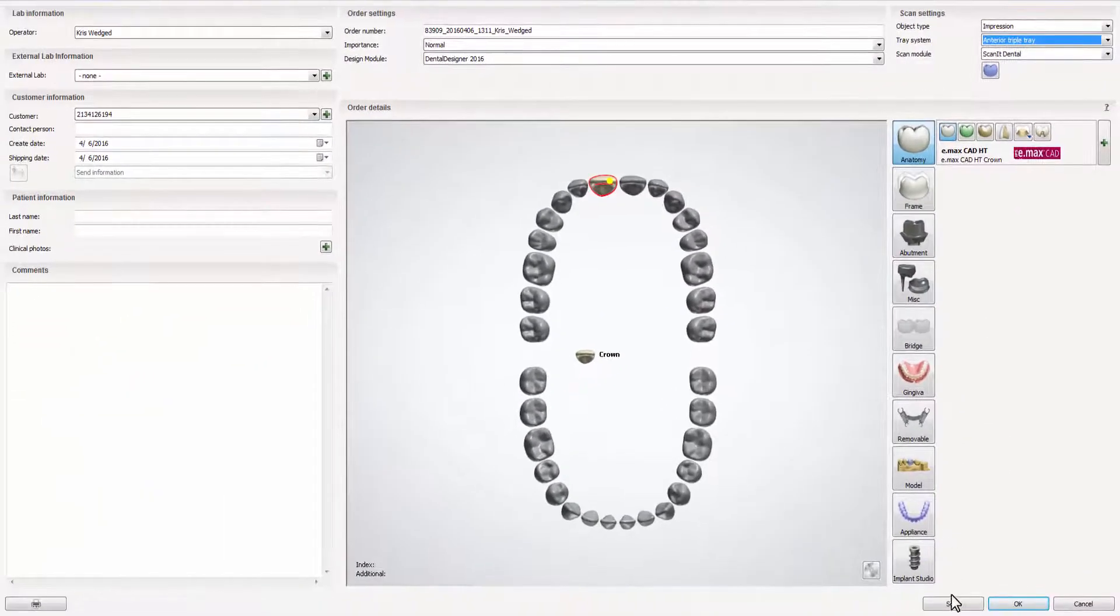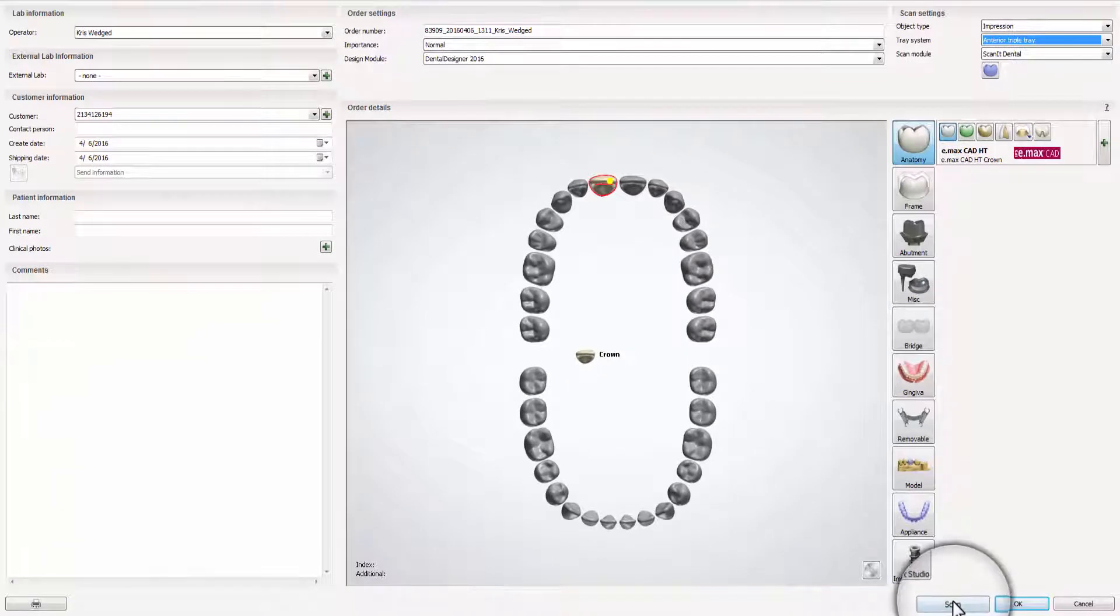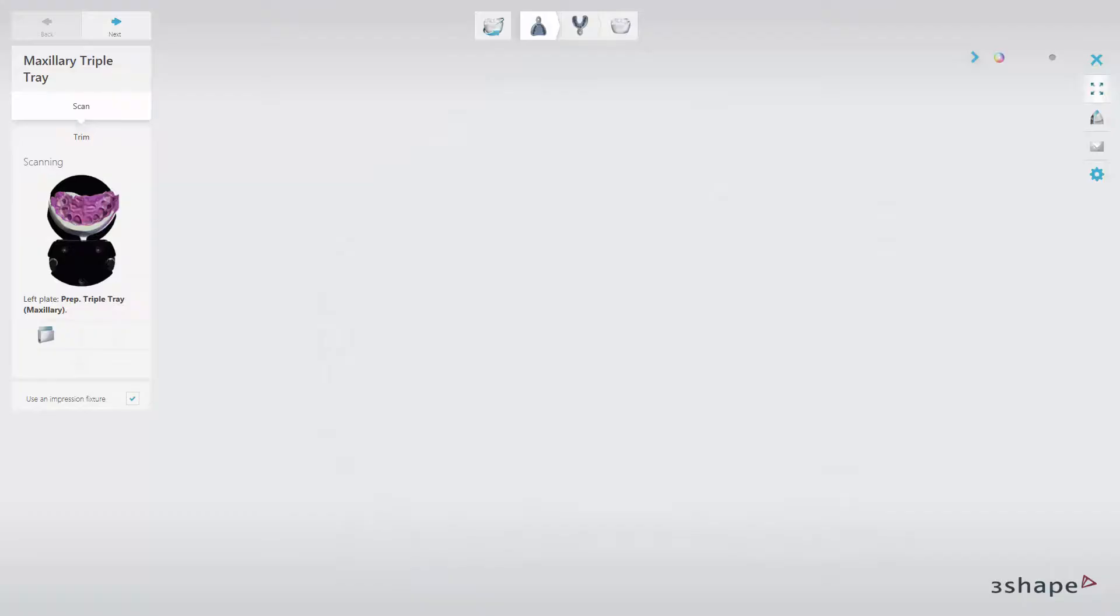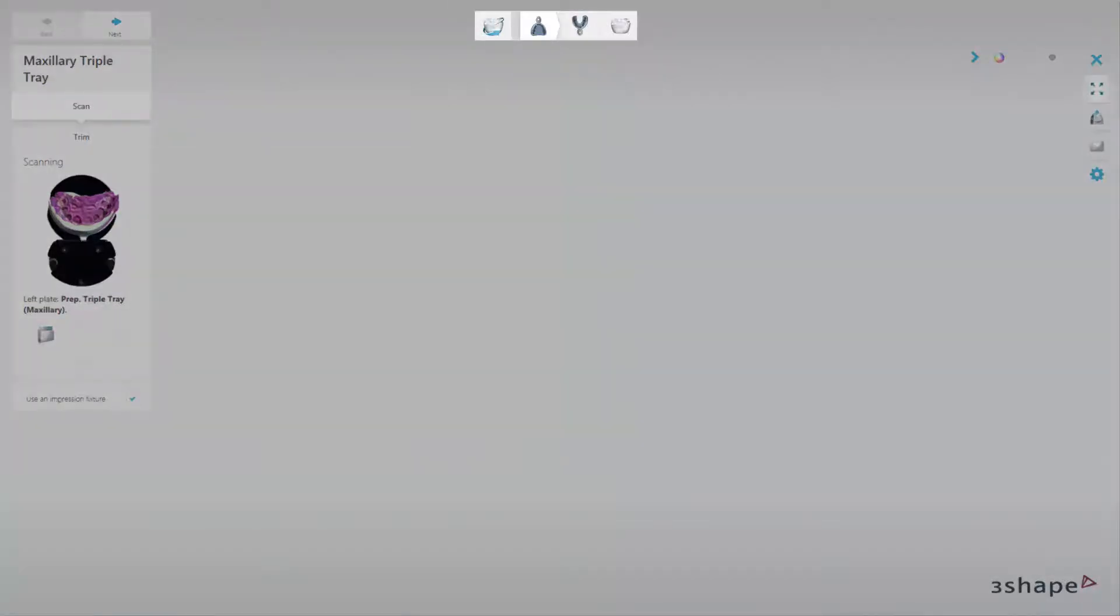Once the order is ready, click Scan. The software will automatically move you to the ScanIt dental scanning engine, where your scanning steps will be indicated on the workflow bar. You can follow these steps or decide on your own scanning order.